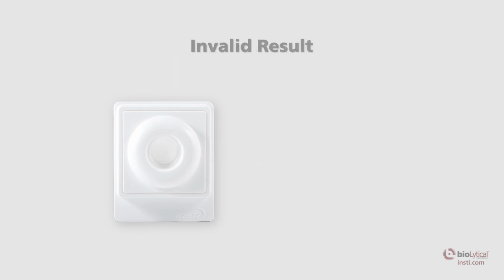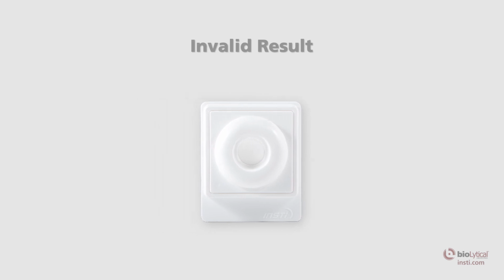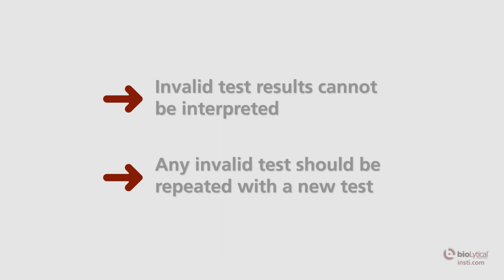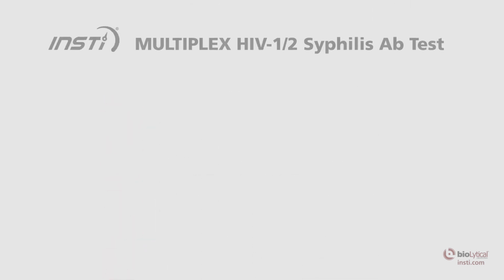Invalid result. The test is invalid if there is no control spot on the membrane. An invalid test result means that the test was run incorrectly or insufficient specimen was added. Invalid test results cannot be interpreted. Any invalid test should be repeated with a fresh specimen using new membrane kit components and support materials.